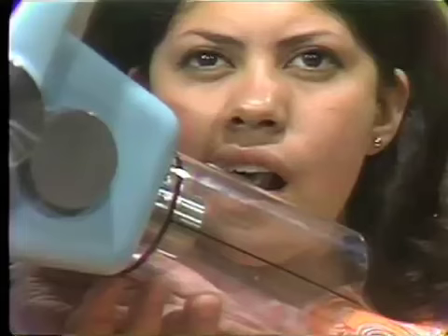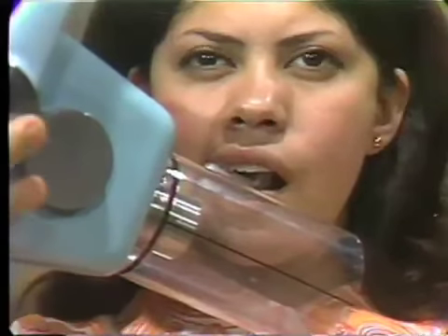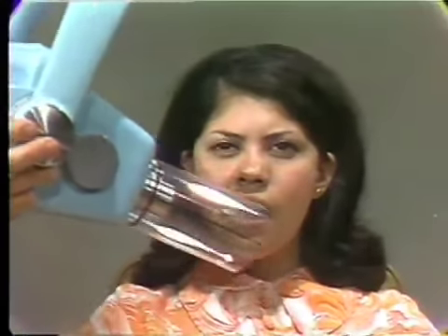There, that's pretty good right there. This has established the vertical angulation. This is the second step in our procedure. Next, we go to our third step, which is the determination of the horizontal angulation.